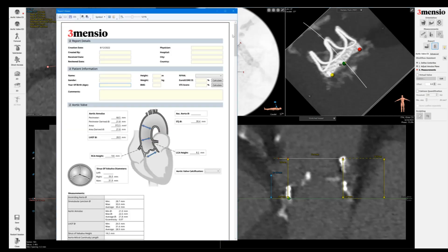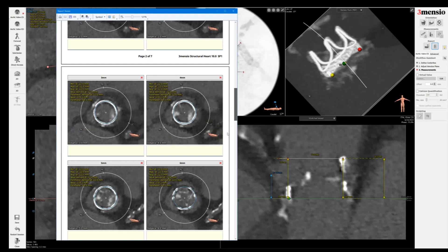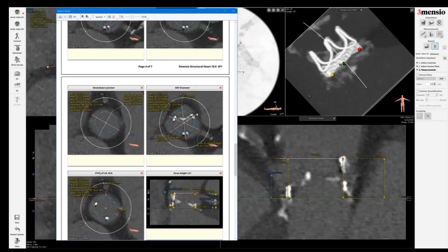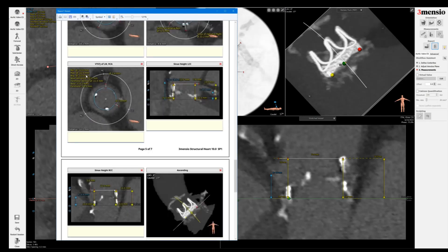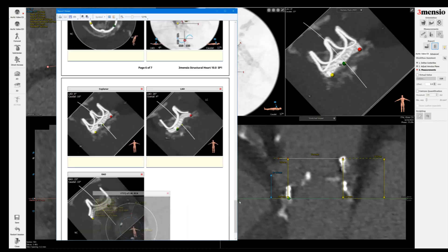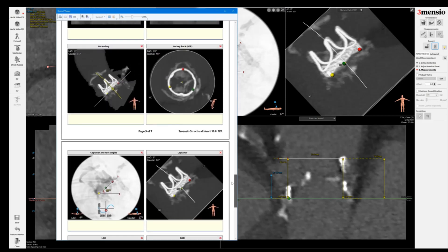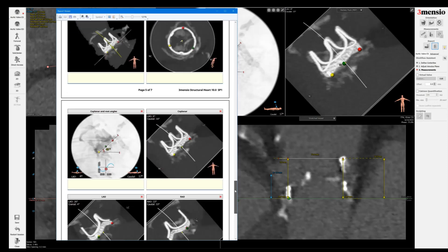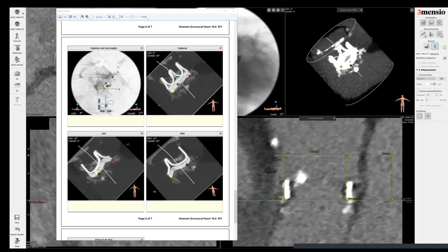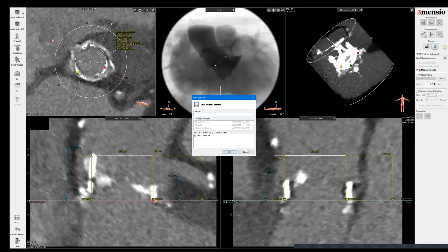Let's take a look at the report. This is a standard report that we do for valve-in-valve, pretty much similar to a native valve. You can see the surgical valve frame at one millimeter cuts, STJ, sinus of Valsalva. This is the virtual STJ to left main — I usually put that at the bottom just to keep the format consistent. You might need more than one measurement here, especially if the root is small and you're concerned. You can see the fluoroscopic view, save this PDF, and share it with the team. You can save your sessions in any format you like.